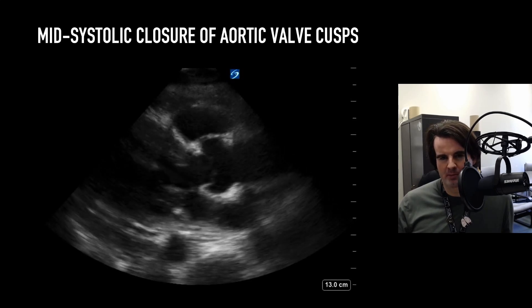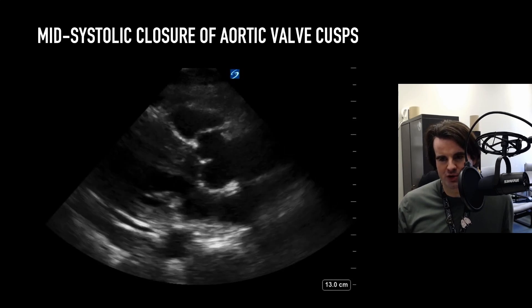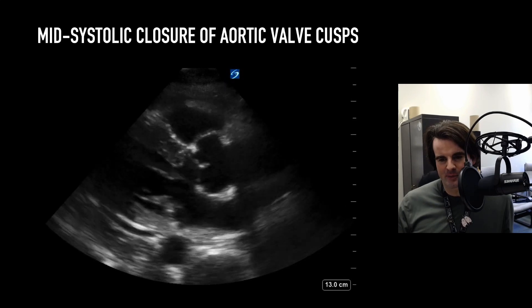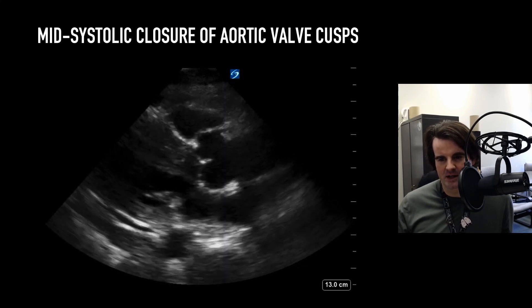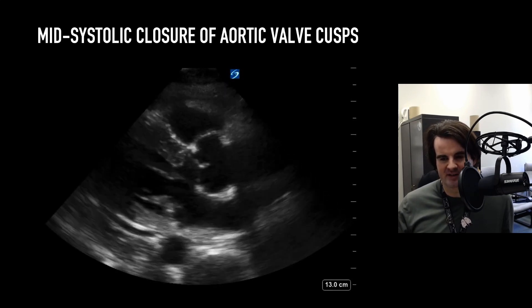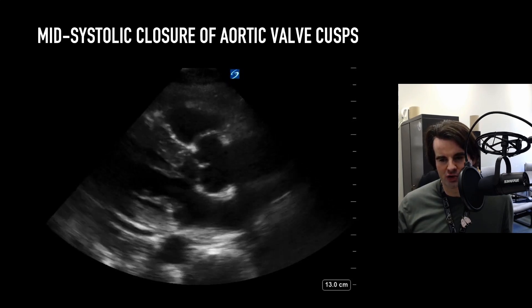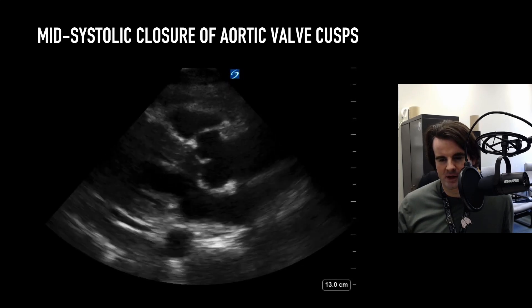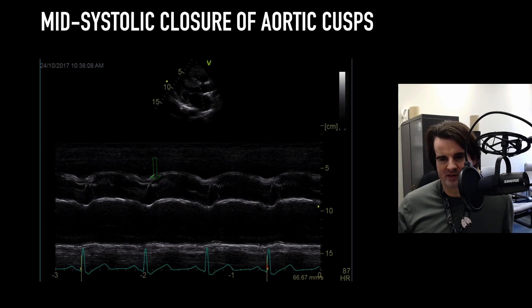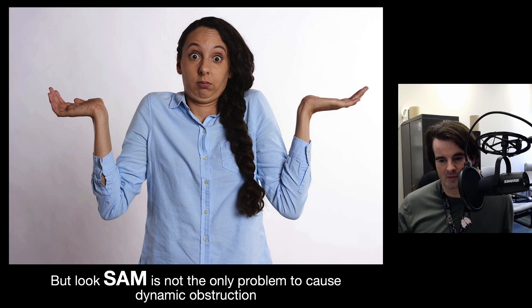We also see a phenomenon called mid-systolic closure of the aortic valve cusps. This is because pressure is not sustained during systole, so the valve actually closes and then reopens all during systole. This can be tracked on M-mode — you see the valve fluttering during systole where the pressure gradient is insufficient to keep the valve open.